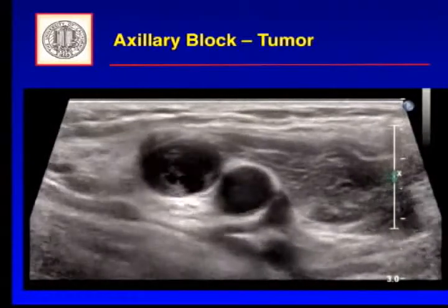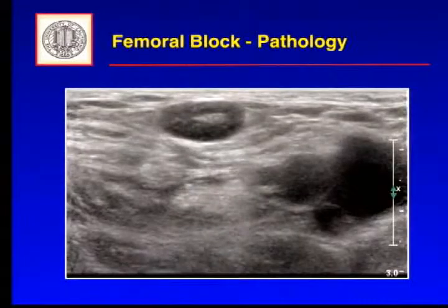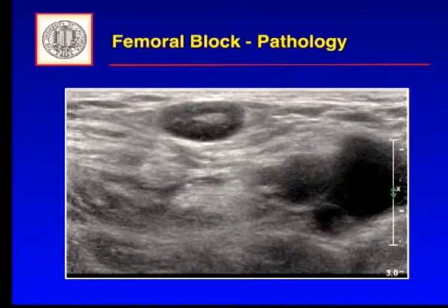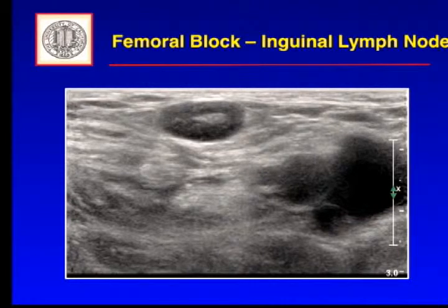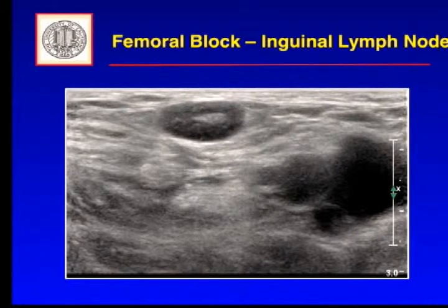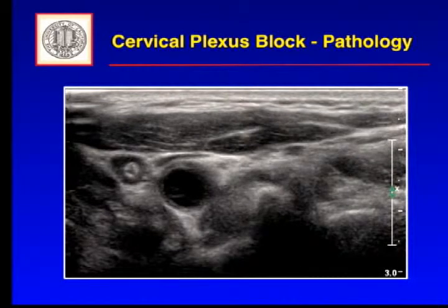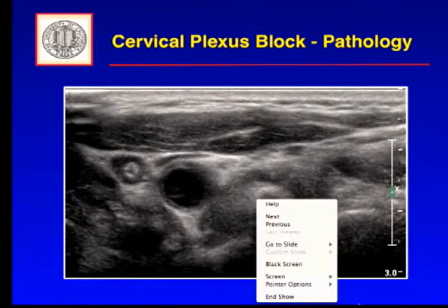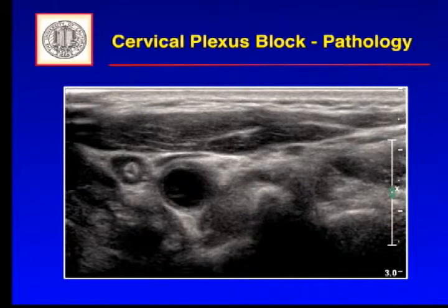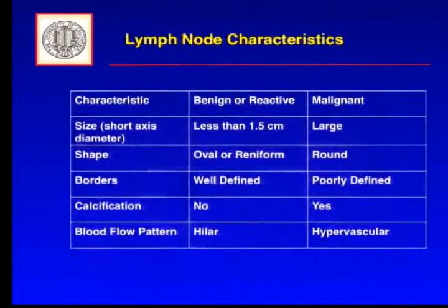For this femoral nerve block, you can see an inguinal lymph node very nicely. The lymph node is not round — it's more oval, sometimes reniform in shape. You can see the hilum in the middle and it's not too large. Here's another one during a cervical plexus block, a bit more concerning with some internal echoes. I do a lot of cervical plexus blocks for thyroid surgery, so we come up with a lot of findings on those scans.